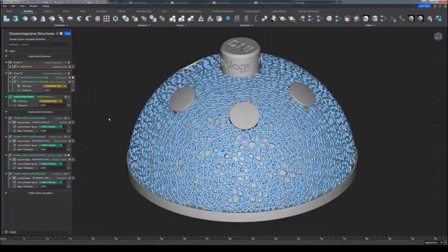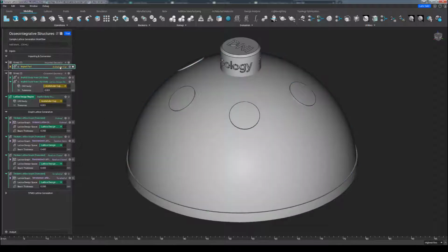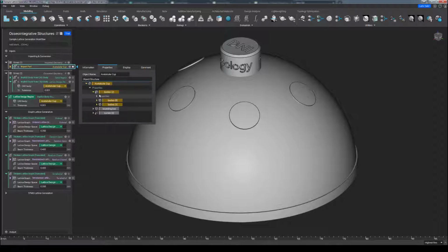Setting up the notebook to use these blocks is quite easy, where the user imports their CAD model as a multi-body CAD part. This means that inside this model, there are two pre-segmented bodies, one representing the solid region and one representing the lattice design region. Even though for this specific example, we have both bodies being imported together within the same model, you may find it easier to manage if these segmented bodies are imported into nTopology as separate parts entirely. This is purely a matter of preference and does not make a functional difference at the end of the day.